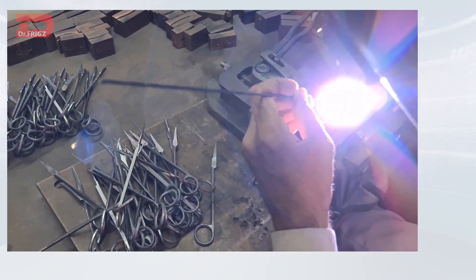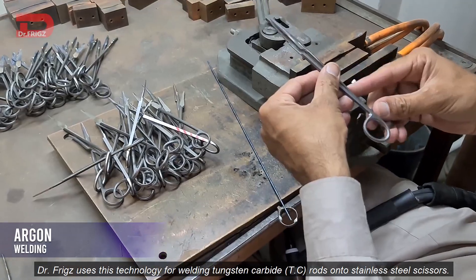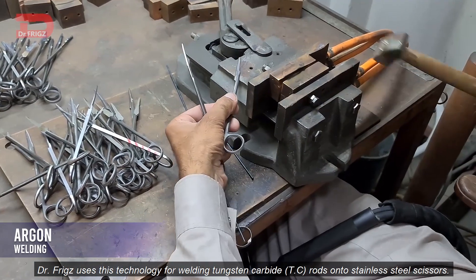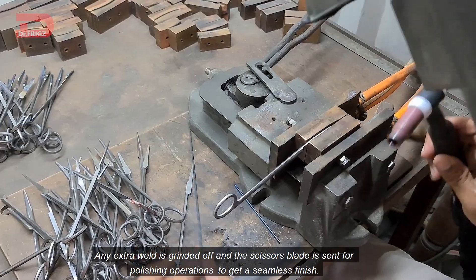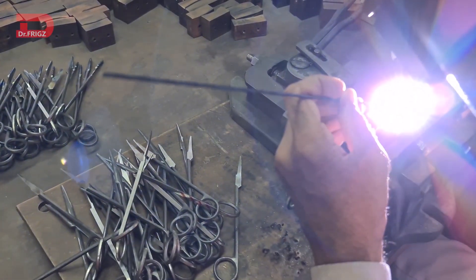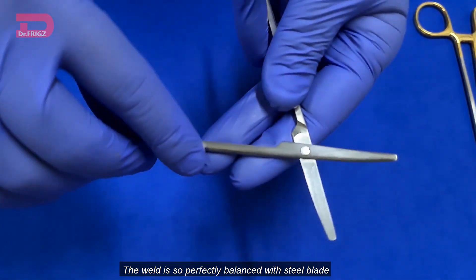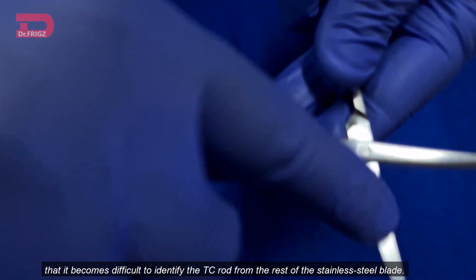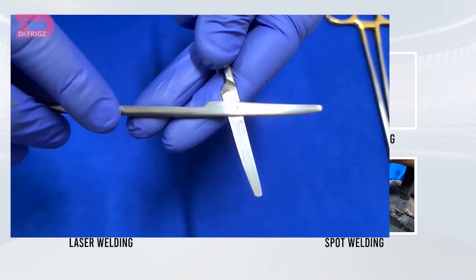Argon welding. Dr. Friggs uses this technology for welding tungsten carbide rods onto the stainless steel scissors. Any extra weld is grinded off and the scissors blade is sent for polishing operations to get a seamless finish. The weld is so perfectly balanced with the steel blade that it becomes difficult to identify the TC rod from the rest of the stainless steel blade.